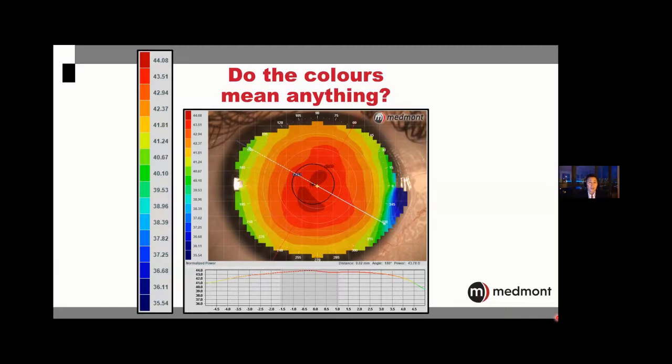Another thing that obviously stands out to us is just looking at the center contours and how we're really not distributing much power within the pupil or across the center 5-6 millimeters of the cornea. It's primarily two colors. It's about a half diopter separated. So imagine correcting this patient with spherocylinder refraction. This is going to be a patient you would expect should refract to a very high level of visual acuity because the central cornea is so normal in power distribution and simple.